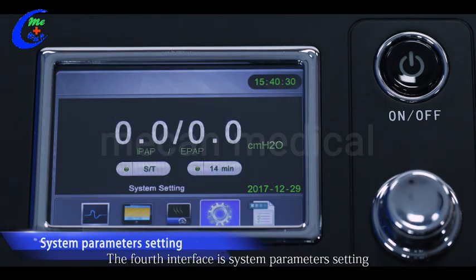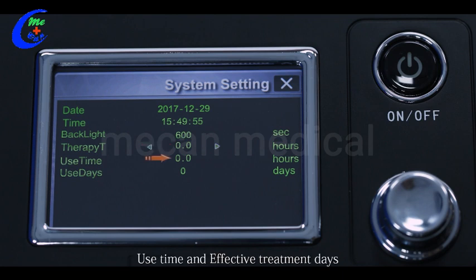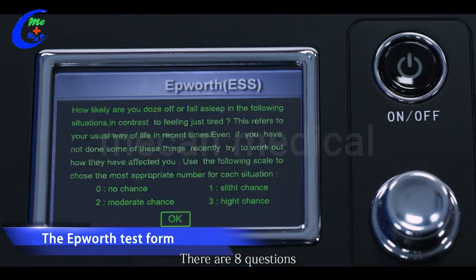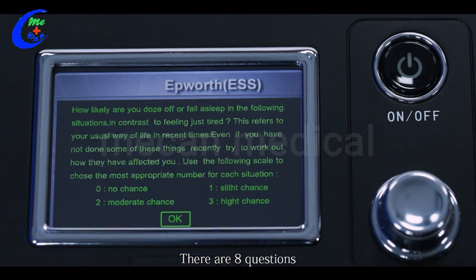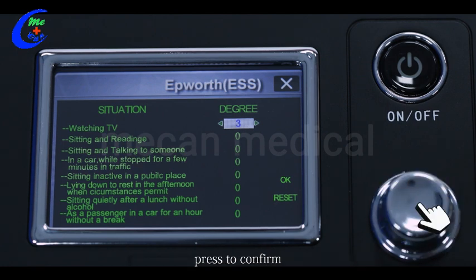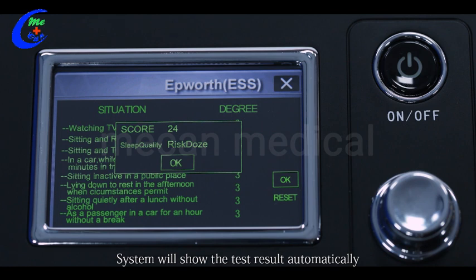The fourth interface is system parameter setting — set the date, time, backlight time, total therapy time, use time, and effective treatment days. The fifth interface is the Epworth test form. There are eight questions; rotate the shuttle dial to answer questions and press to confirm. After finishing all questions, move to OK and confirm. The system will show the test results automatically. Users can refer to the result to make a rough judgment about their treatment.